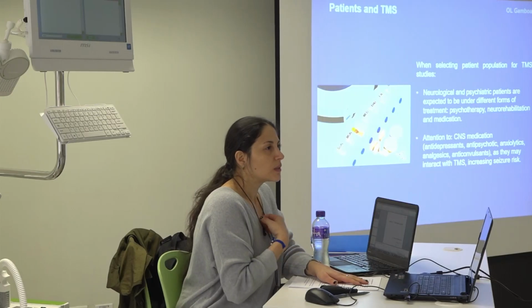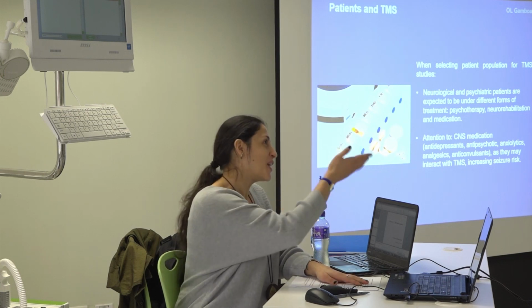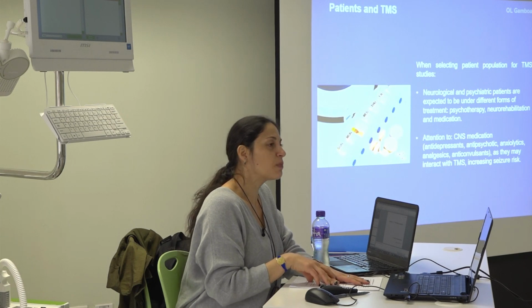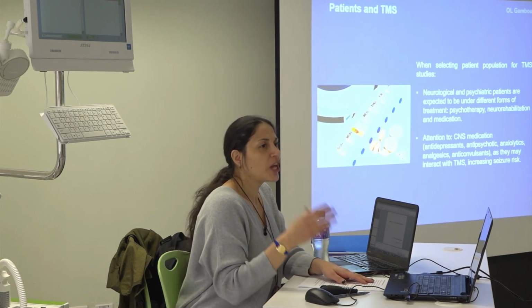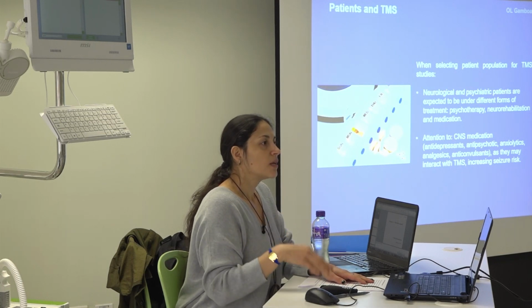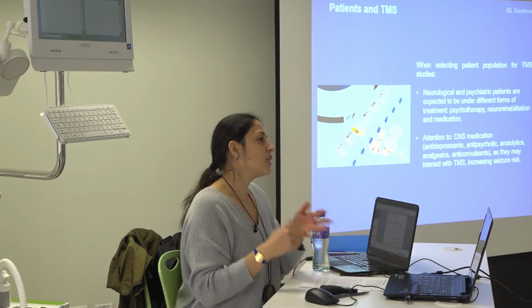I think it's good that when you are working with healthy subjects, you do the drug test. It's kind of cool because it's also your safety. People will lie, and we have had the situation that they lie. Not with heavy drugs, not in my study, but I know it has happened with other persons, with marijuana, right? It changes the excitability of the brain, you will not get exactly the same. You don't want to measure that, because if you are doing EEG or whatever, everything will be a little bit different.